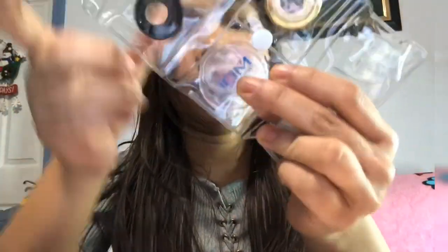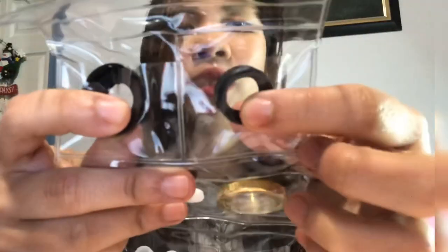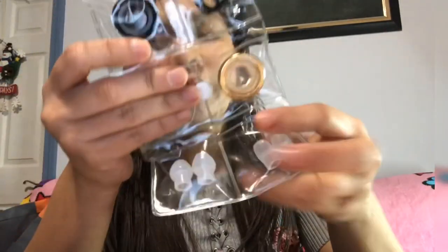They also provide spare earpieces and covers in the box. If you want to change your bell to infant, children, or adult size, you can do that — it's already set to adult. The brand is MDF. There are also spare earpieces and a handle ID tag so people know it's yours — just put your name on it. You can put the stethoscope around your neck or in your pocket as a nurse, but usually it's worn around the neck.